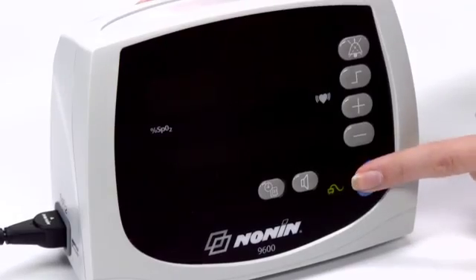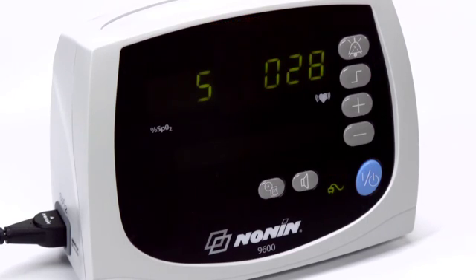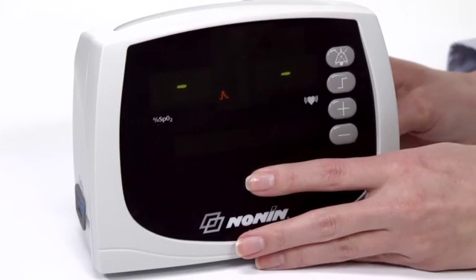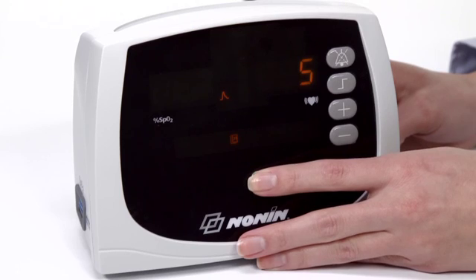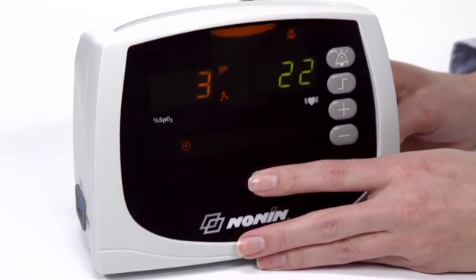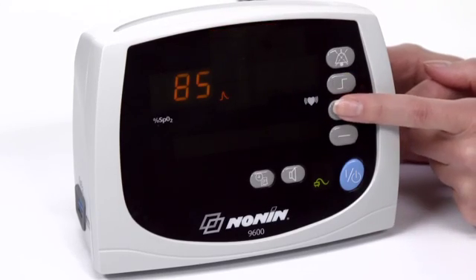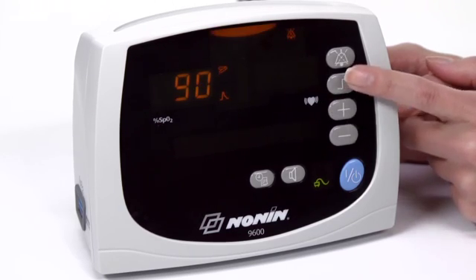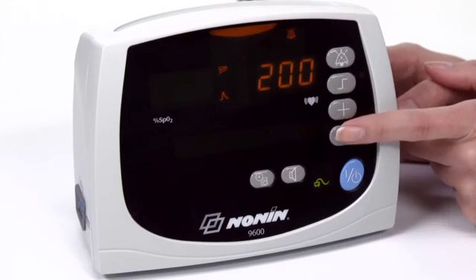Press the on-off button to start the unit. The oximeter will run through a start-up check as it turns on. Check the oximeter's time and date settings for accuracy. You can set the time and date by pressing the clock button and using the scroll buttons to set the proper time and date. Alarm ranges can be customized by pressing the alarm limits button and then using the plus or minus button to scroll to the desired setting for each limit. Alarm limits will return to the default settings when the oximeter is restarted after being turned off.